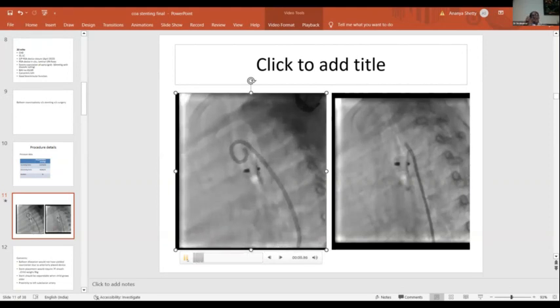One interesting point that I observed during your presentation was that you took the stent directly without a long sheath. Is that right? Yes, sir. Does that mean you did not have even a 7 French sheath in the groin and you just pushed the stent through the femoral artery? In the groin, we had a 7F sheath, sir. We didn't use any long sheath. Okay. Does that have any impact, like a long 7 sheath versus a short 7 sheath, on the vascular access complication? I think it will be more or less the same, no? Whether it's a 7 long or a 7 short. The injuries at the iliac bifurcation can be prevented, is what I read in some articles, sir. Yeah. Thank you very much. That was a wonderful presentation.